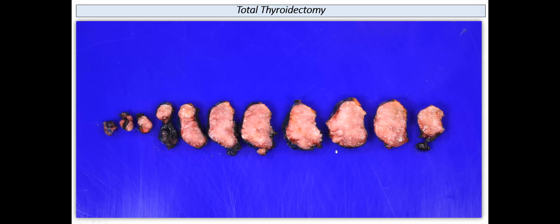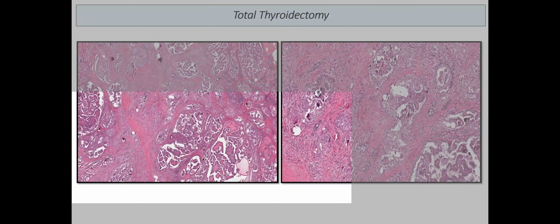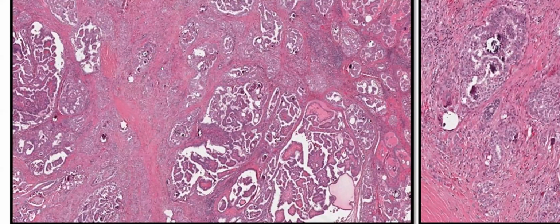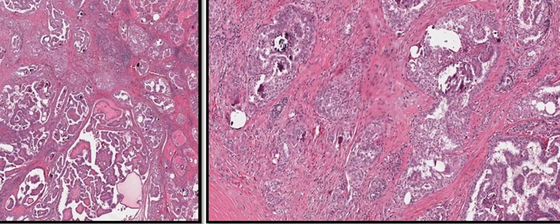This is the follow-up on this, and this is the thyroid gland, which shows you a diffuse process, and you can see there's some fibrosis in it, but there's no normal thyroid left, a little bit probably here and here, but most of this is the tumor. This is the histology. The main tumor mass did have papillary structures. So you can see here, fibrosis in the background. And here you can see some of them are solid groups.